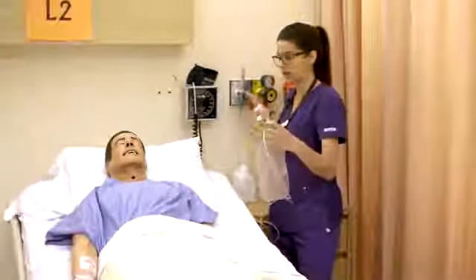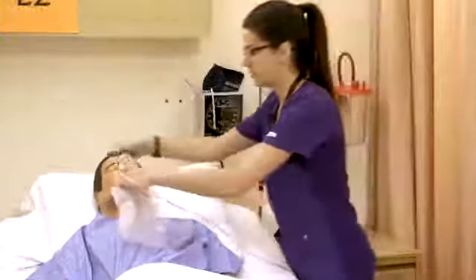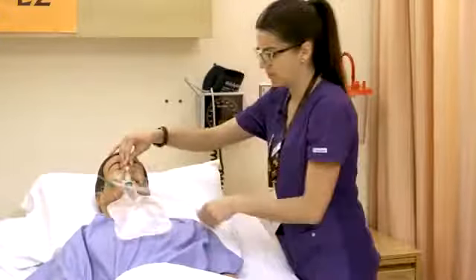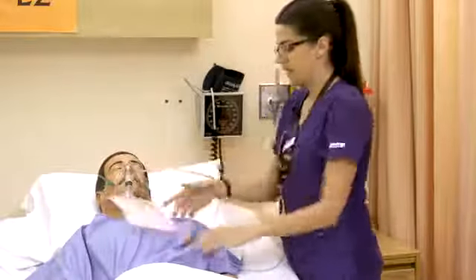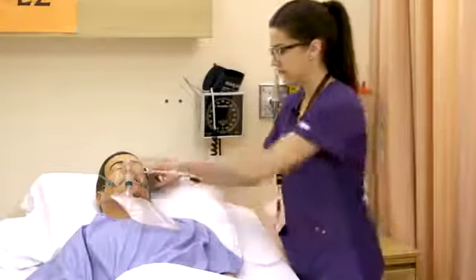So this is kind of our high flow guy. So we'll put him on. Same idea as the other face masks. Put the mask on the person's face and attach that over the bridge of their nose. This can be adjusted a little bit too. And then we want to make sure that reservoir bag is nice and full.